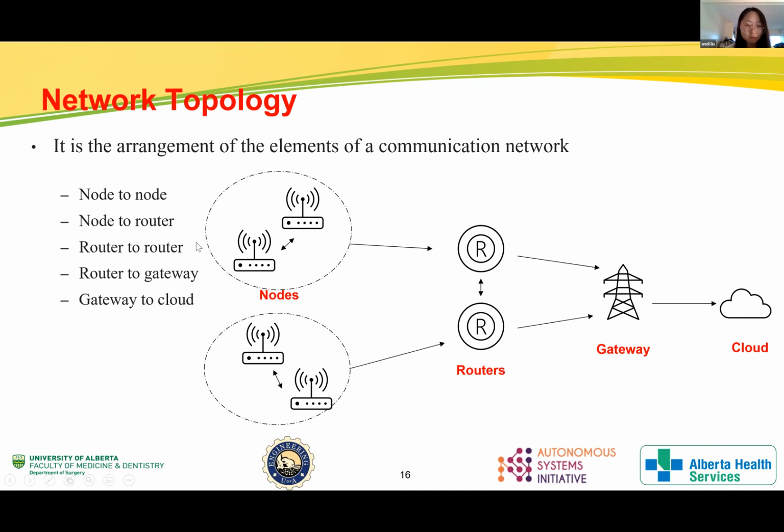The communication between nodes is also necessary, since due to the BLE configuration, one BLE device can only connect up to 7 devices in total. In that case, when more than 7 nodes want to connect with one router or gateway, you will need another node to be put in between and use it as a router.